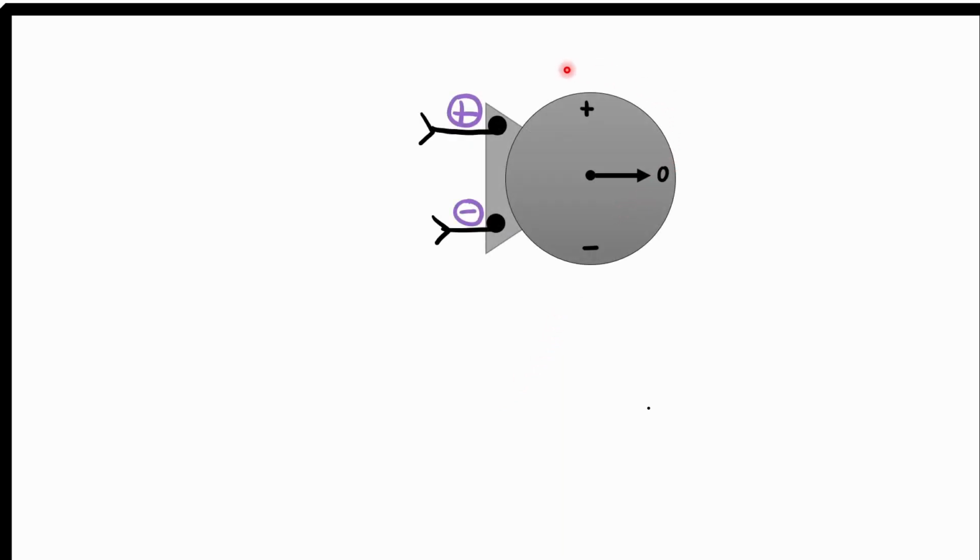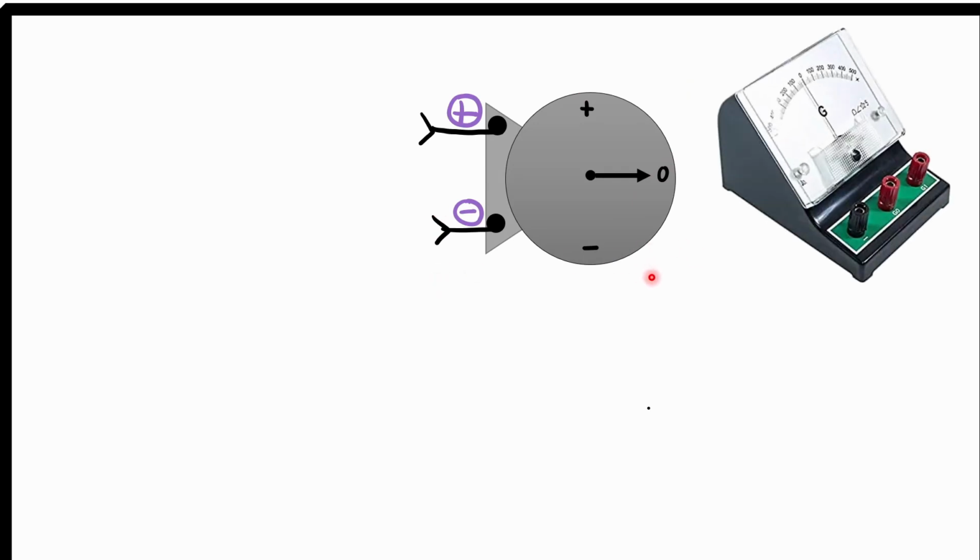To record the heart activity, we use ECG machine. This uses the basic principle of galvanometer. I hope you all have seen this galvanometer in your physics lab. It shows the electrical activity by deflecting its needle. Okay, no need to go so deep.